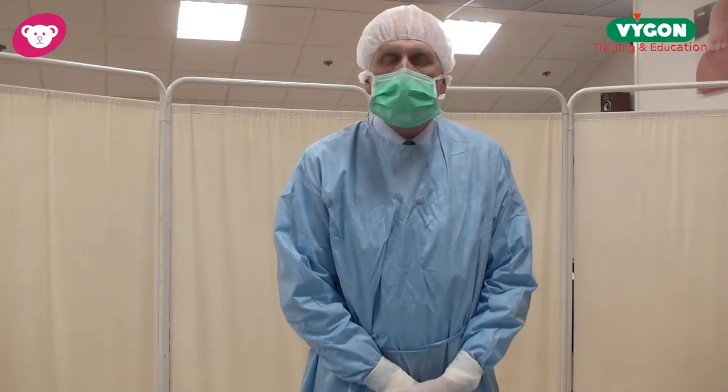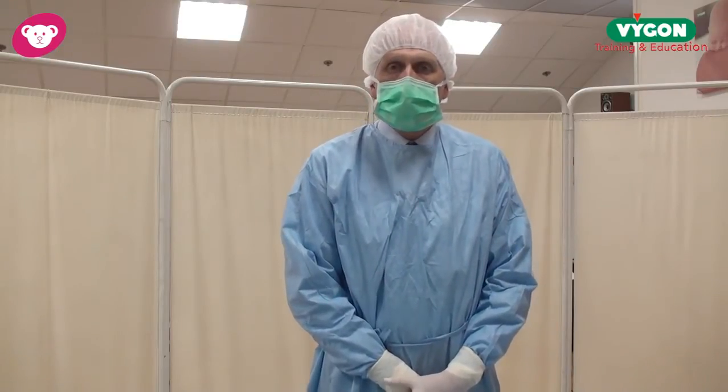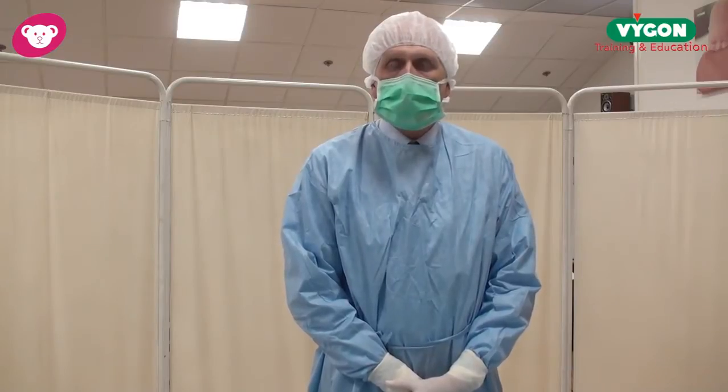Hello, my name is Alan Martin, the Clinical Director for Vygon. I would like to show you today our new umbilical tray, and this is essential for placing umbilical catheters in the NICU.